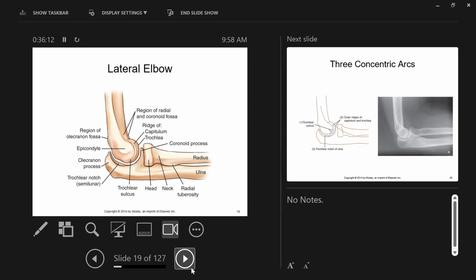So, you get somebody seated in a chair, lateral elbow, they're up like this, right? What do you have them do? What are you going to tell somebody to do when they're up like this, they're not down? I can raise the table maybe, right? Does everyone have a raisable table? No, not everyone, right? But lots of us do. If I don't, I lower the chair, yeah? Let's say the chair's as low as it can go. What else can I do?